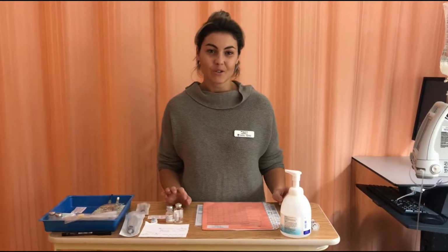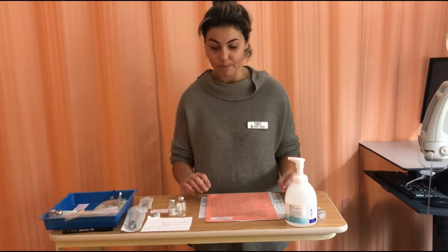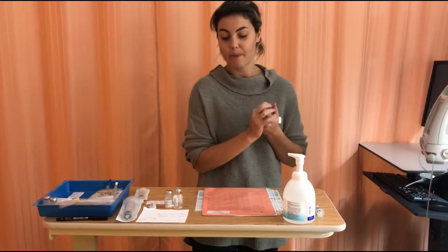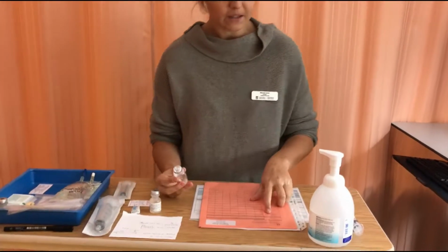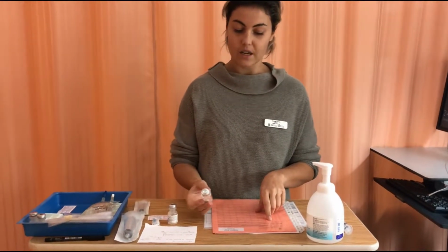Hi there, my name is Miranda Unruh and I'll be demonstrating how to reconstitute an IV medication and administer it through the CIVA pump. So I'm going to start here with just a little hand hygiene and then my first med check. So I have penicillin here. The order is Penicillin G Sodium 3 million units IV Q4 hours in the CIVA pump.